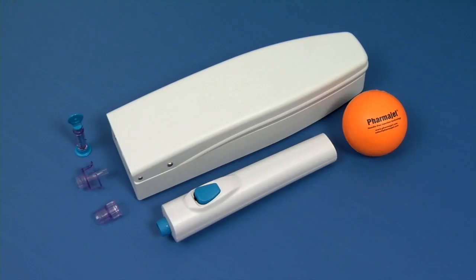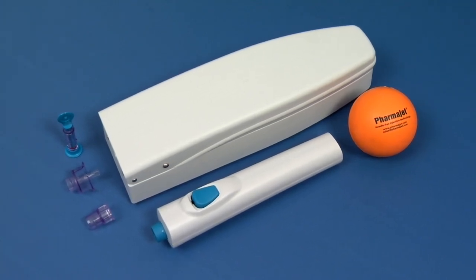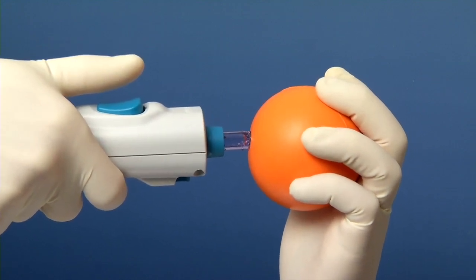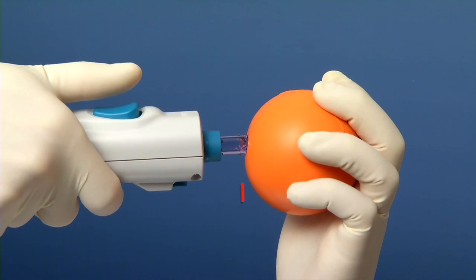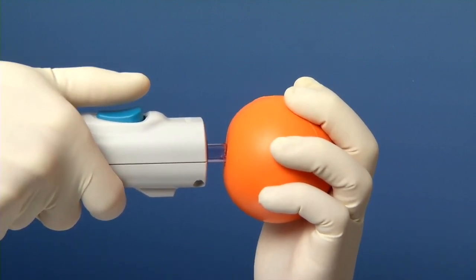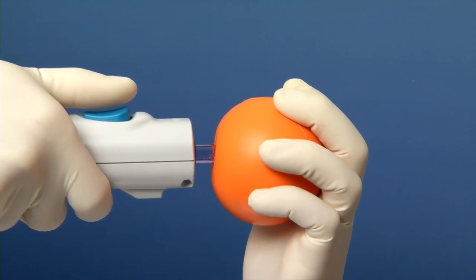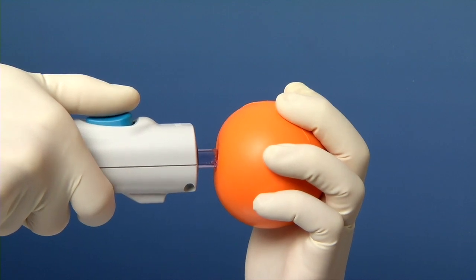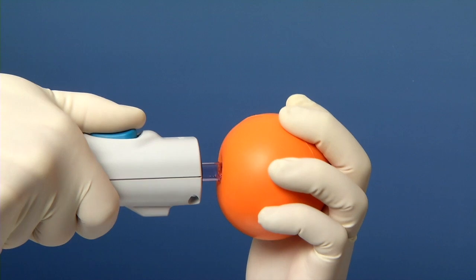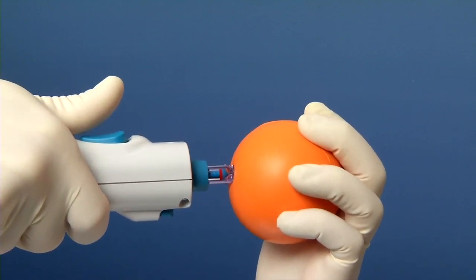Practice. Before injecting patients, please practice using the rubber ball provided with your starter kit. Remove your thumb from the multifunction button and engage the rubber ball by pushing the syringe against the injection site at a 90-degree angle. Apply gentle pressure until the blue retractable ring is fully depressed. Depressing the ring fully releases the safety. Now, while maintaining a steady pressure against the injection site, press down on the multifunction button to inject. A click will be heard upon injection.